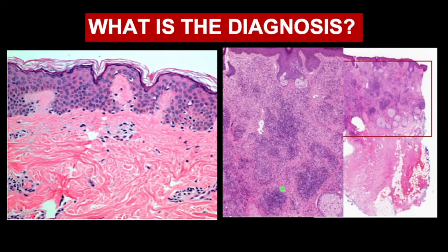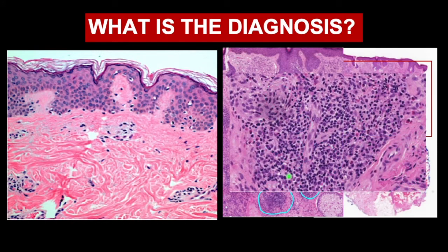They are not granulomas similar to the granulomas we discussed in the previous chapter, where we see lymphocytes, histiocytes, and giant cells. Here, a collection of lymphocytes forms a kind of granuloma formation. And if you go on high power, you also identify eosinophils. So those cells are not just lymphocytes, but a mix of lymphocytes, plasma cells, a collection of plasma cells here, and also eosinophils.